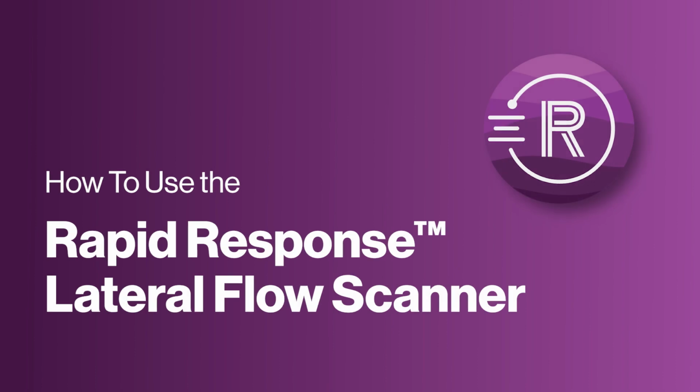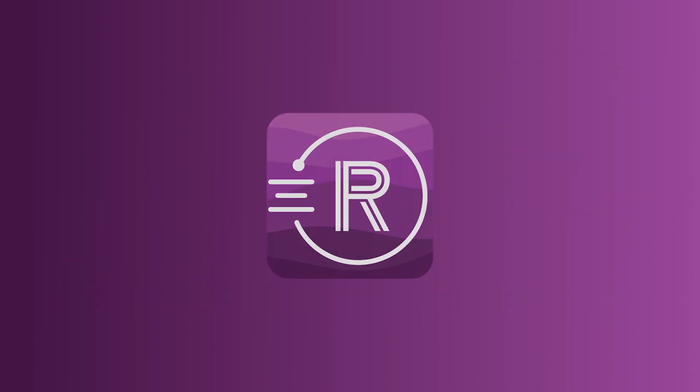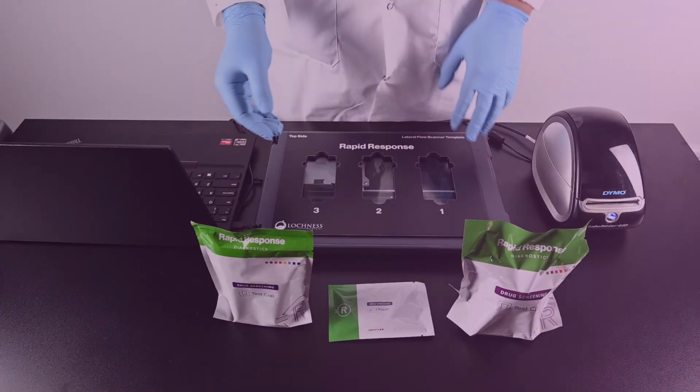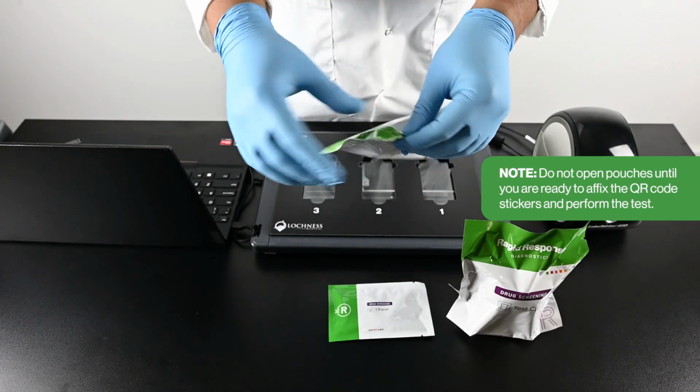How to use the Rapid Response Lateral Flow Scanner. Open the RRScanner Software. Follow the testing procedure outlined in the product insert supplied with the Rapid Response drug screening products to test each patient sample.